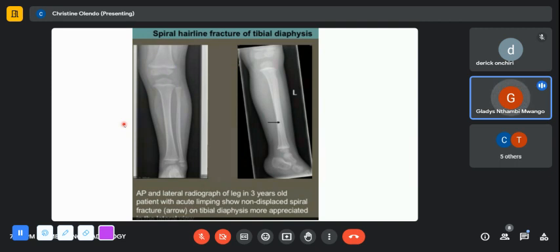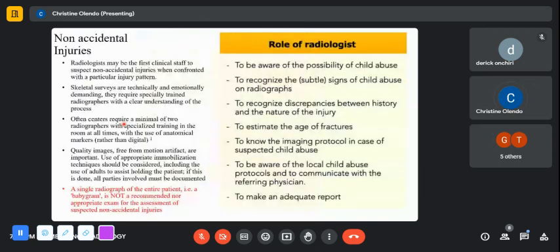Of course, an MR would pick up the fracture quite well, because again you'd see on the fat suppressed T2 the increase in marrow intensity. Then you know that is where the issue is. And you may see fluid tracking through the cortex. All right. Thank you.